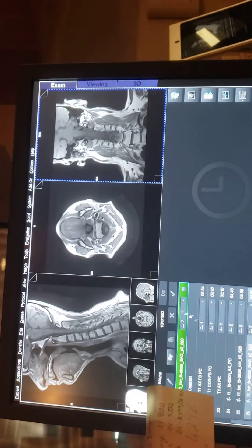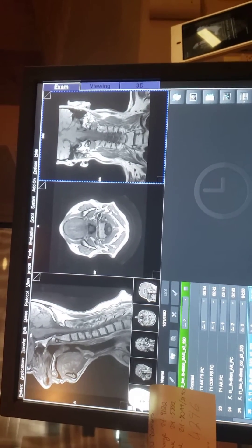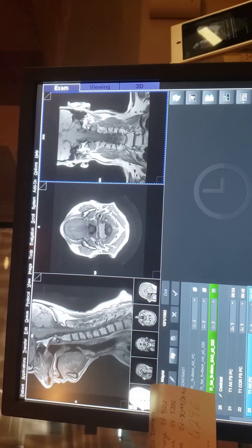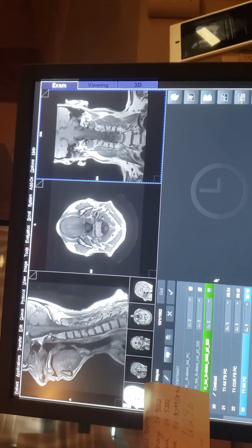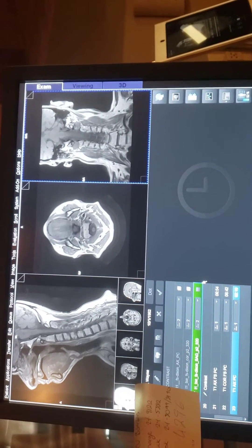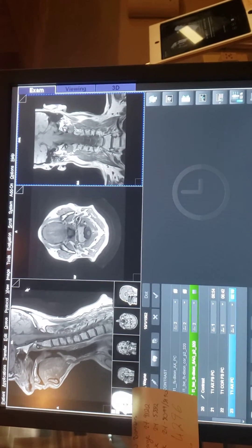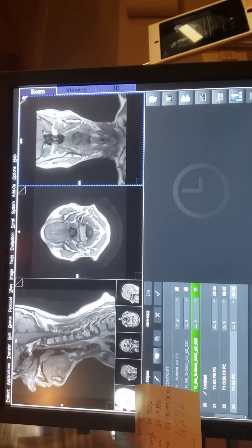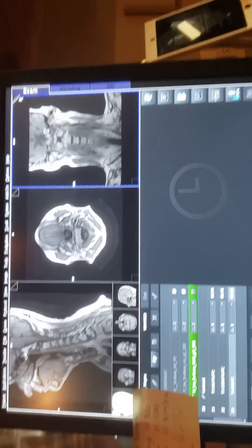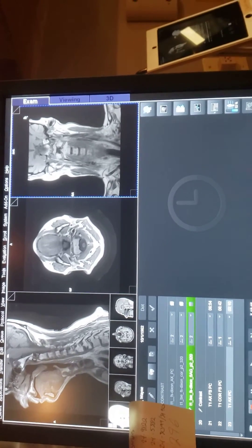And that's it — nothing to it. These are the pictures I got. As you can see, this is the whole neck, so it's not like a C-spine or anything. Thank you, bye bye.